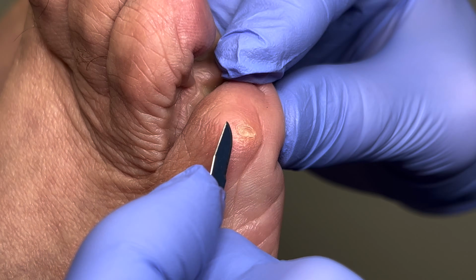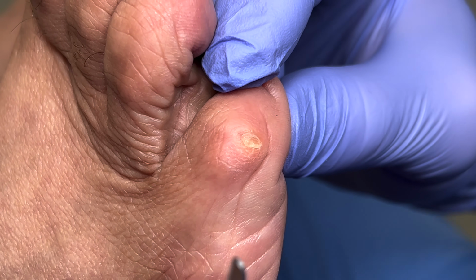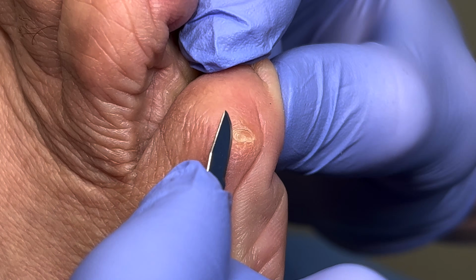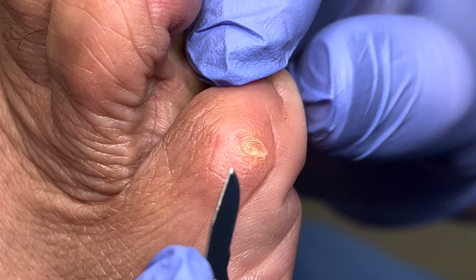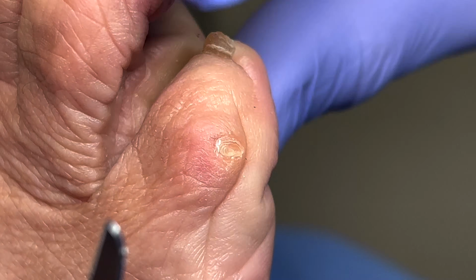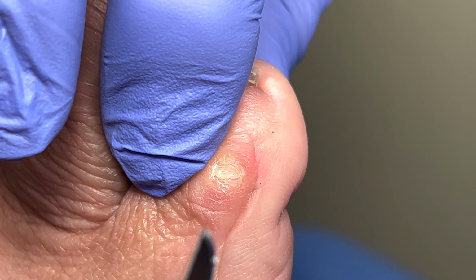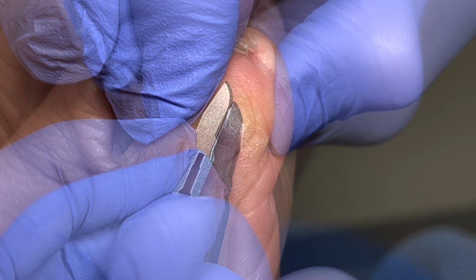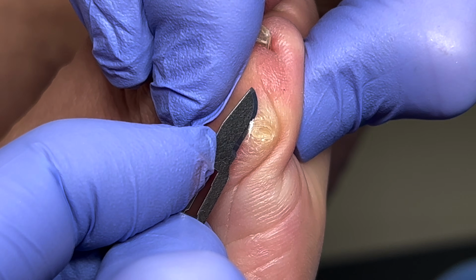What we're going to go ahead and do today is enucleate the lesion. This is only the Band-Aid, right? Sometimes I like to give some counter pressure like that, and very carefully.